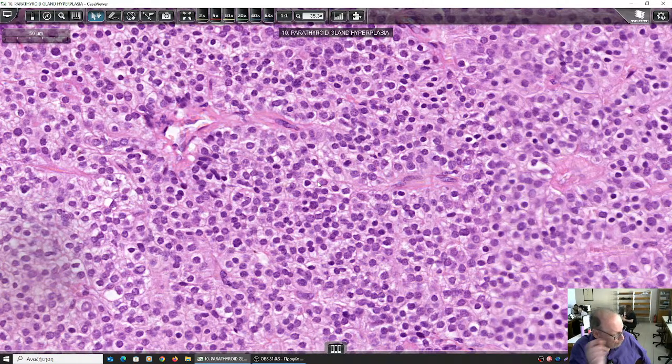calcium and increased parathormone. So you have to check the parathyroid glands if they have hyperplasia, as is the case in this slide, or an adenoma, or very rarely a carcinoma, which causes very, very severe hypercalcemia. But if the parathyroid glands are normal, then you have to check secondary hyperparathyroidism. That means if there is a kidney disease that is responsible for the hyperplasia of the parathyroid. This is the case in uremic patients with renal insufficiency.